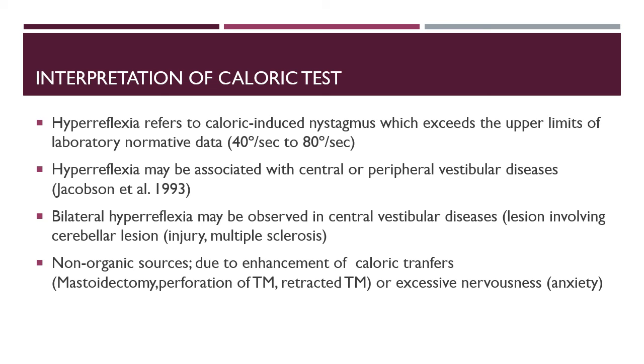Hyperreflexia refers to a caloric induced nystagmus which exceeds the upper limits of laboratory normative data. So its value is over 40 degrees per second to 80 degrees per second. Hyperreflexia may be associated with central or peripheral vestibular disease. In peripheral vestibular disease, hyperreflexia may be seen in the contralateral labyrinth to that with a deficient response.